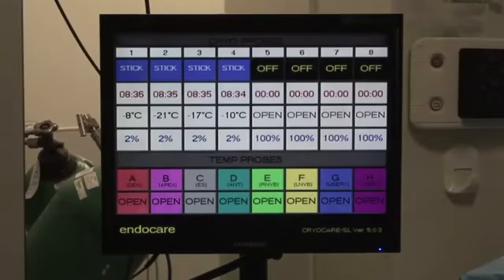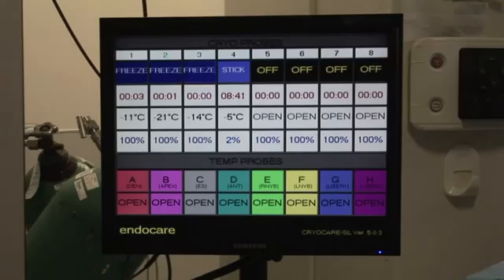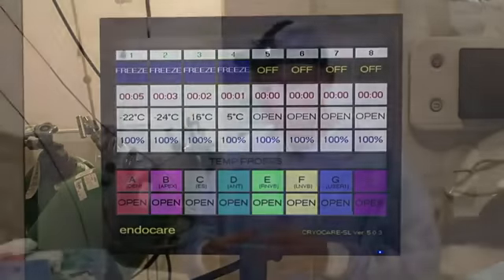So the stick thaw is over, the 8-minute stick thaw is over, and Michelle has started the second cycle, which I suspect will be shorter than the first cycle because even though we've been thawing, we're starting in a cold substrate, and especially with multiple probes in, I find that the second cycle is usually a couple of minutes shorter than the first cycle. I'm expecting 8 minutes, so we'll look at 4 minutes instead of 5 minutes, and if I want to go beyond 8 minutes, I certainly can, but we're just going to keep a closer eye on it because it's going to be a very big, very intense ice ball here.